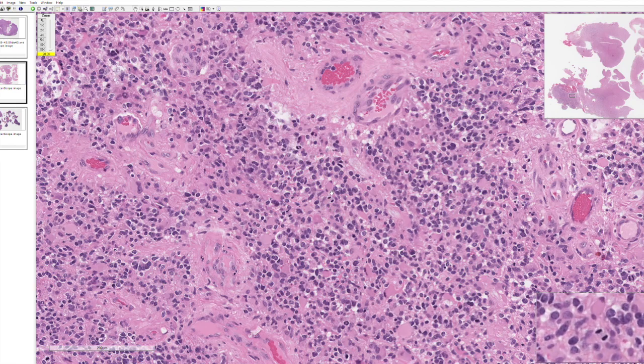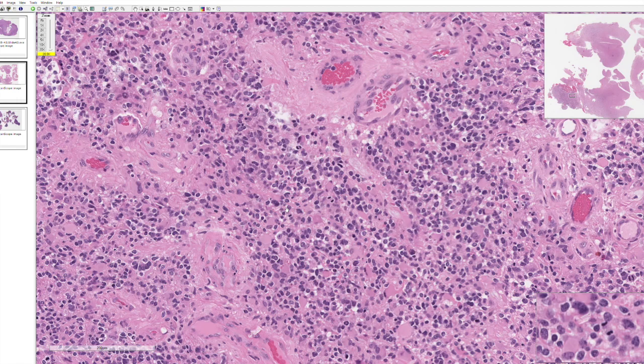Here is another anaphase, a cell dividing to form two daughter cells, and another one. And because of this rapid proliferation that we're seeing in this cancer, these drugs are very effective in killing 99.9% of cancer cells. But for whatever reason, there are some cancer cells that appear to be much more slowly dividing and thus are not subject to these cytotoxic drugs.